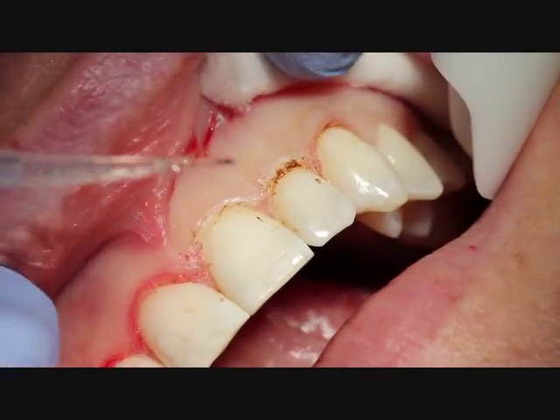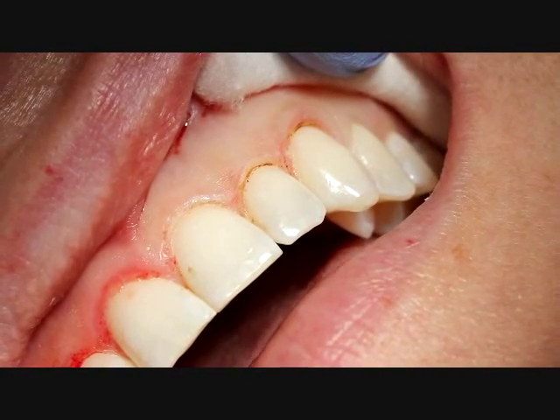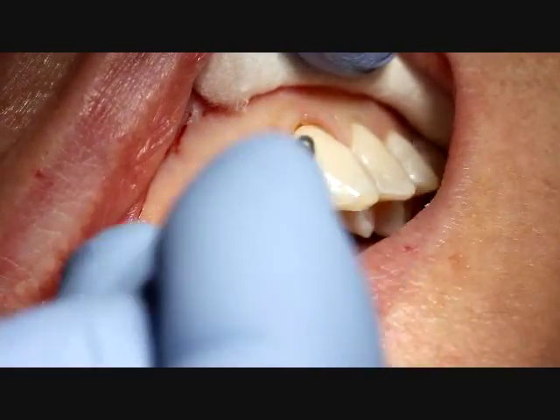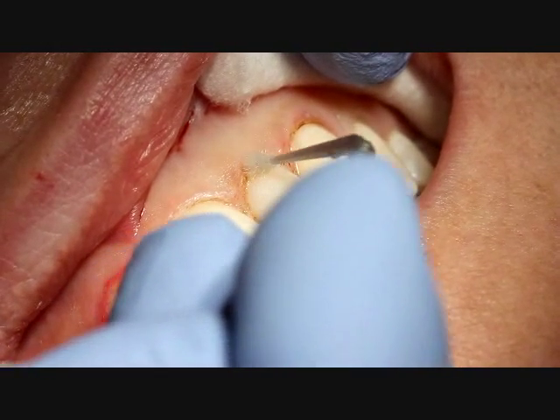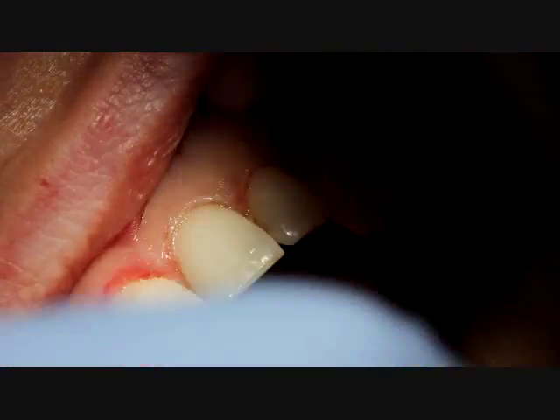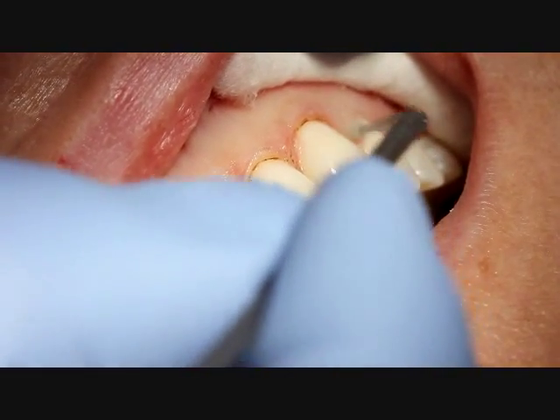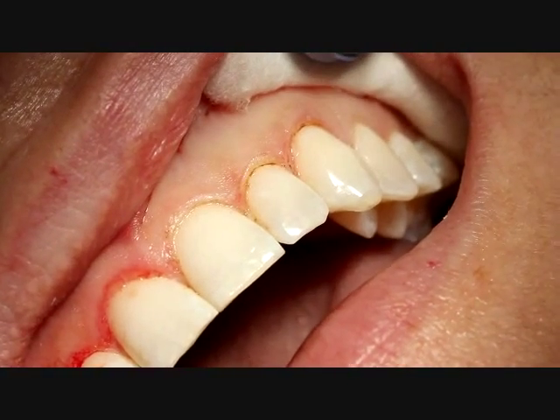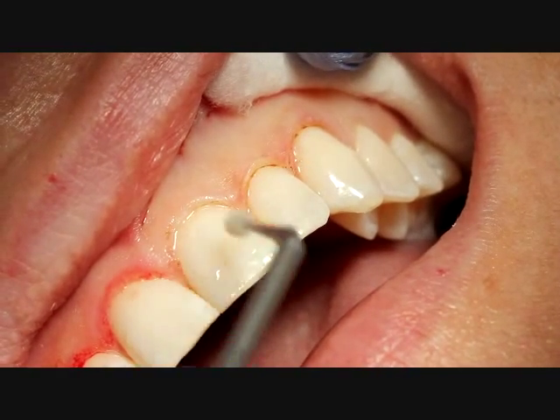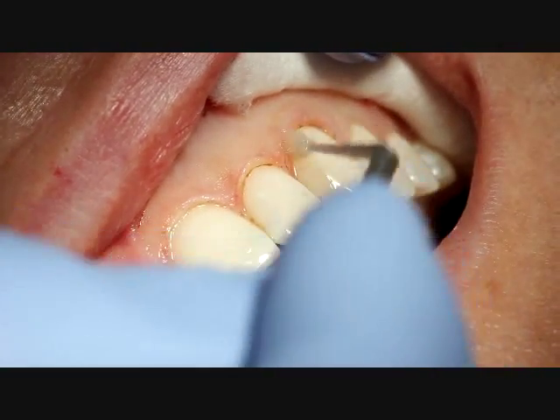Remember to wipe the tip as you are doing the procedure. Then we'll go in and start to use a little chlorhexidine to actually clean that little pigment and clean up the little tissue tags on the teeth. Here we've started to clean the tissue up with the chlorhexidine microbrush — that's going to remove any of that little pigment or stain caused by the laser, and it's also going to help remove any little tissue tags that may be left when utilizing the laser.